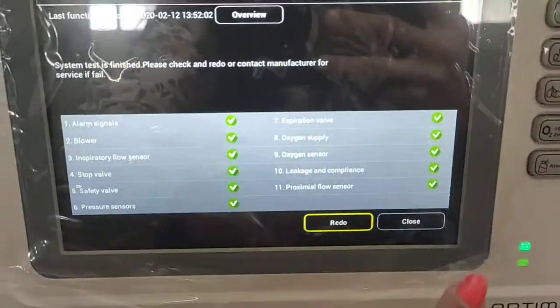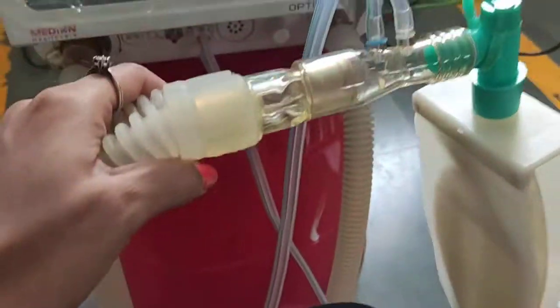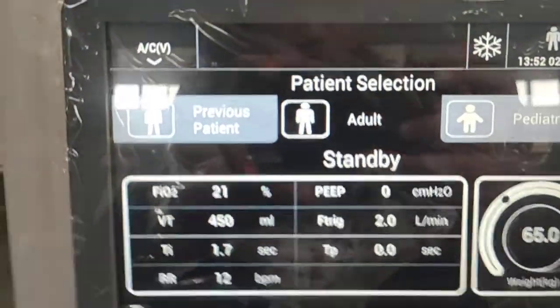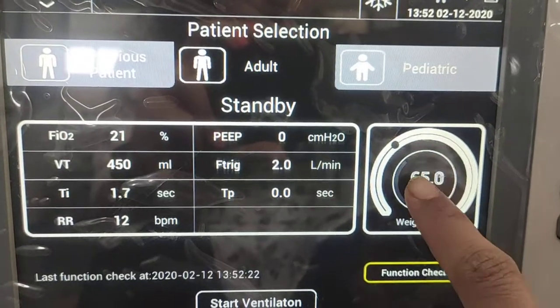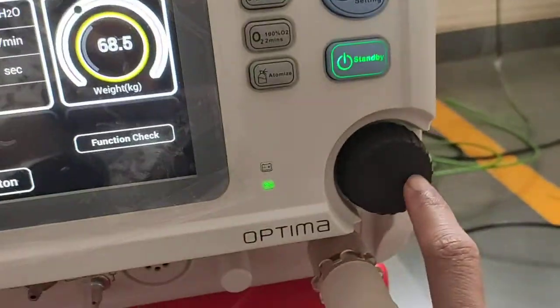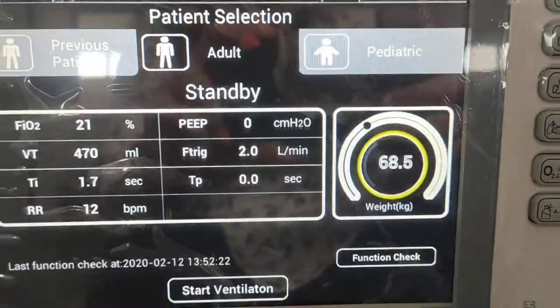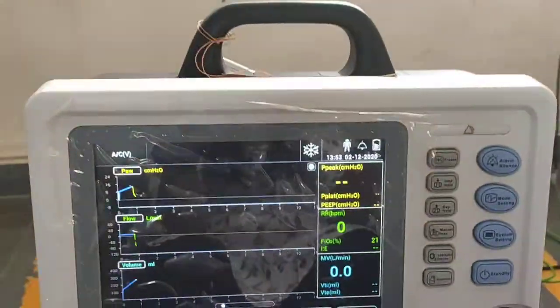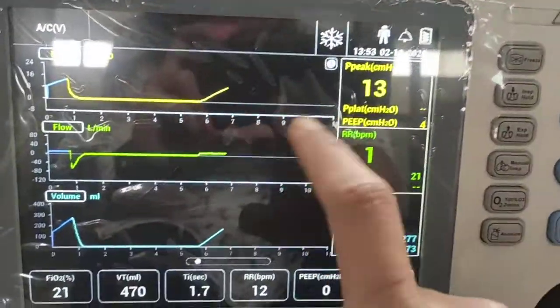After completing the test, close it and connect your patient circuit. On the patient selection screen, there is a previous patient option along with adult and pediatric selections. Select the patient type and adjust the patient weight using the rotary knob, then press to confirm and start ventilation.